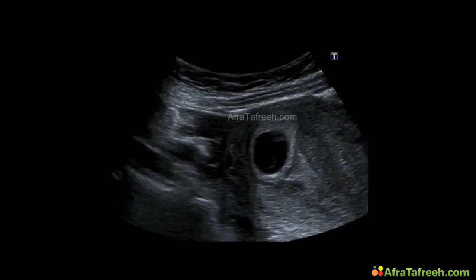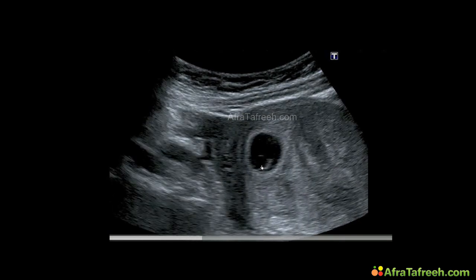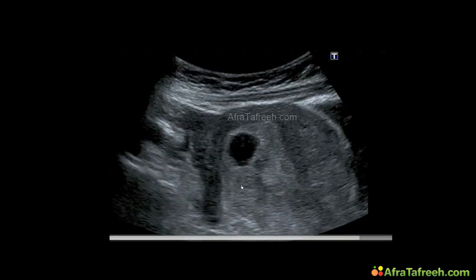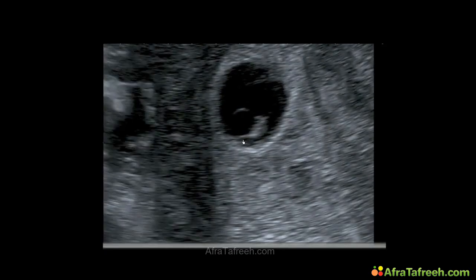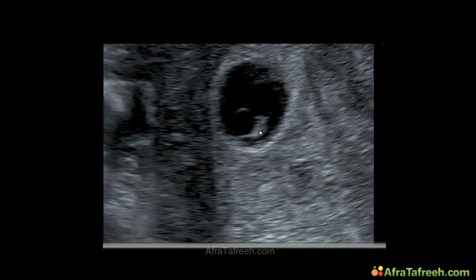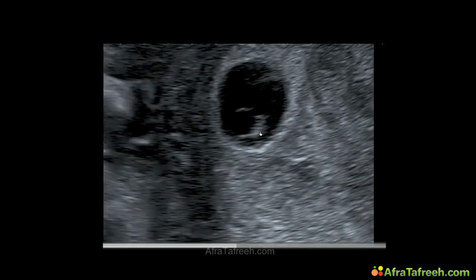In this case, we detect an enlarged uterus with a lesion over here, a cystic lesion there, which also shows solid parts in this area. So when we take a closer look and zoom to this structure, you can identify a small solid structure in this cystic area, and there is a positive heartbeat. This is a pregnancy of the 7th week.